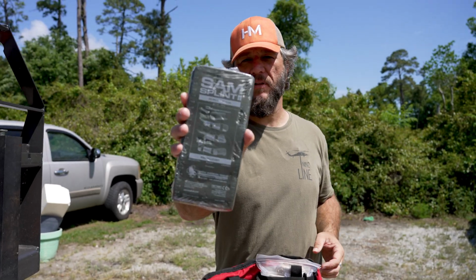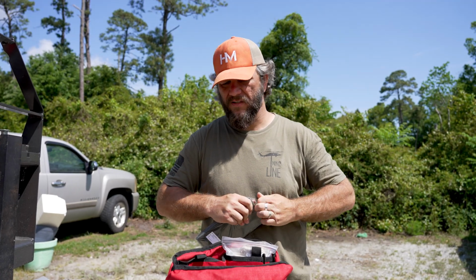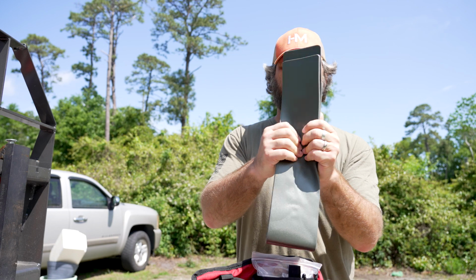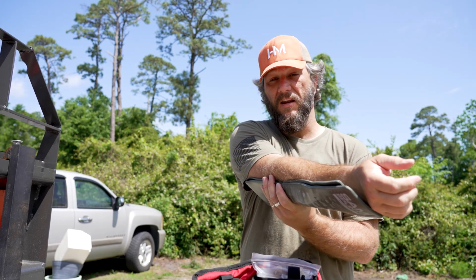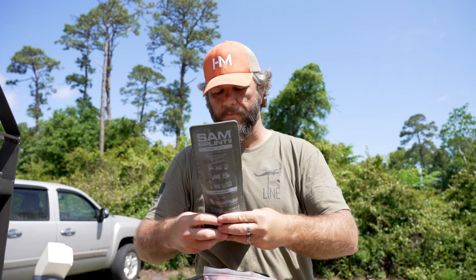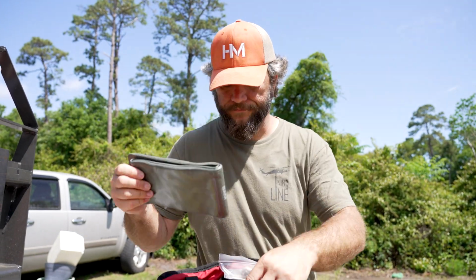Here, this is a SAM splint. I kind of hate to take this stuff out, but you know what? You don't really know what this stuff is if I don't show it to you. So it's got this soft foam on the outside, but it's stiff so that you can shape it around your arm. And then if you needed to wrap it, you would wrap this around your arm and it creates a splint for you. But yet it's nice and storable.